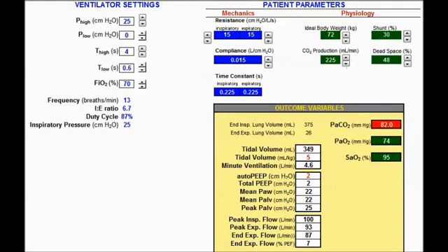First, I'm going to set my T-low setting by targeting a peak expiratory flow rate of 50 to 75%. Now, like I said, my P high is going to be constant. I'm going to have my P low set at 0. As I said before, T high of 4 seconds is a common setting in APRV. And a T low, we're going to titrate to get that 50 to 75%.